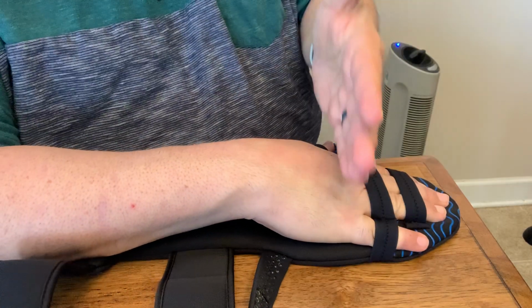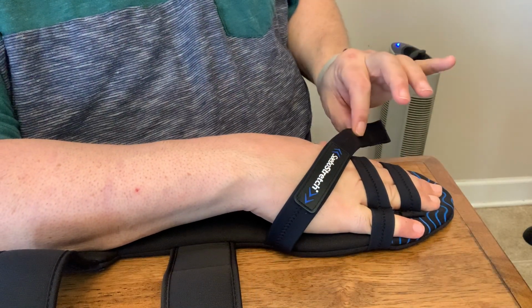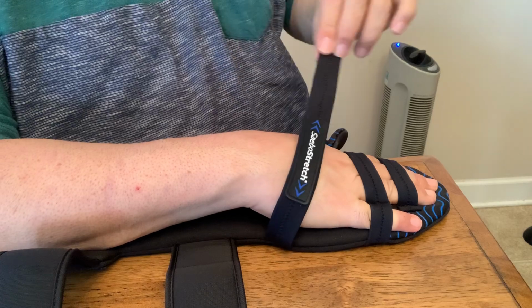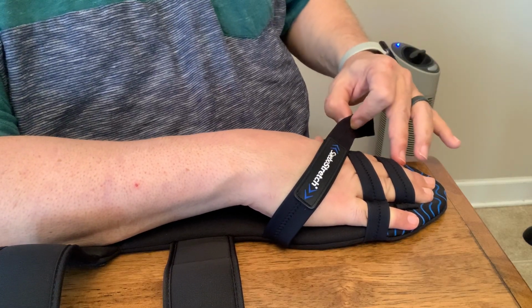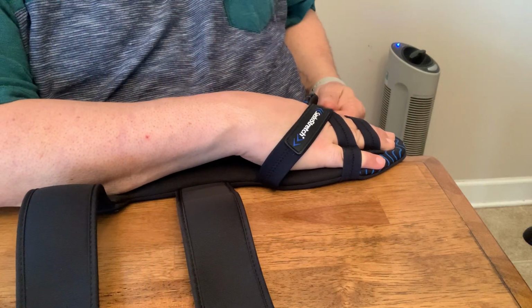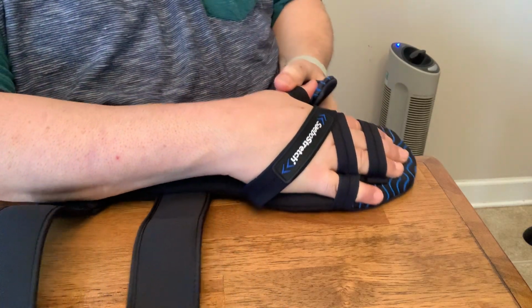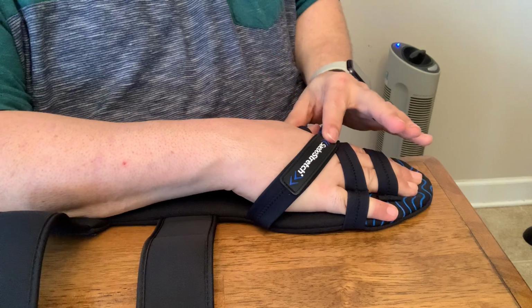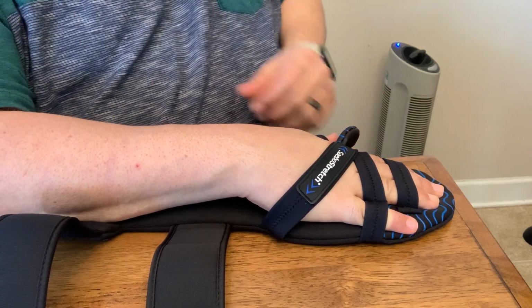So we want to keep these knuckles down and firm. So we go diagonal. Instead of this, do this and go between your thumb and your pointing finger, okay? So come to the edge of the table again and tuck under the pad, half on, half off. So you've got some Velcro room. So I've gone diagonally, I've got my knuckles secure. So it keeps your hand flat and relaxed.